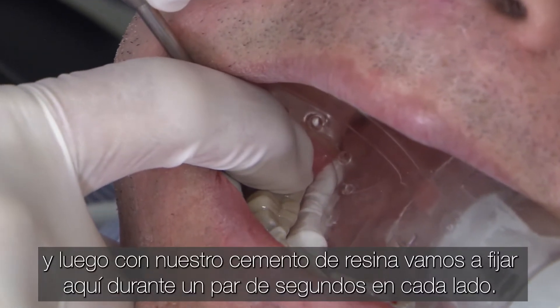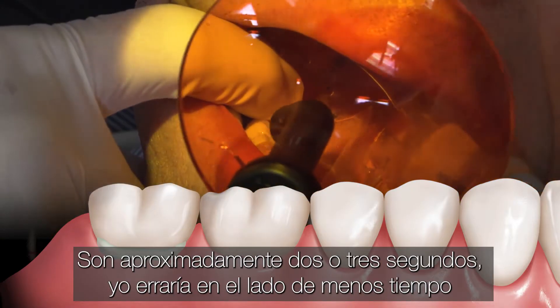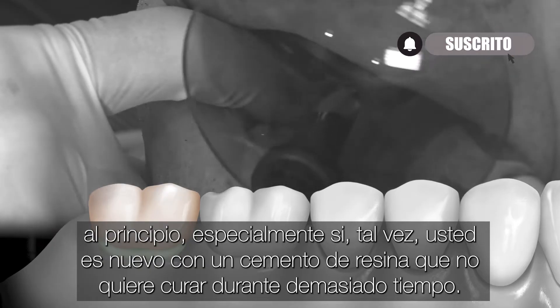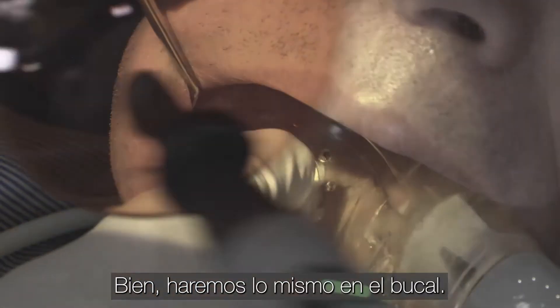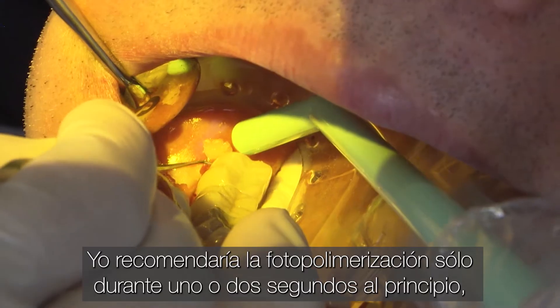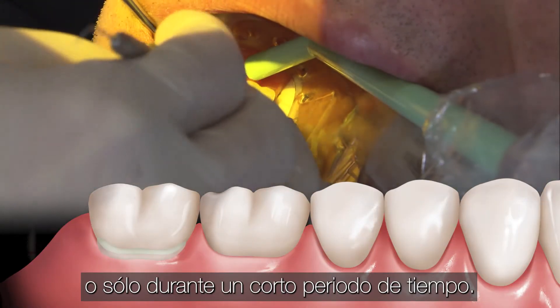With our resin cement, we will pack here for a couple of seconds on each side — about two to three seconds. I would err on the side of less time at first, especially if you're new to a resin cement. You don't want to cure for too long. We'll do the same thing on the buccal there. I would recommend light curing for just one or two seconds at first, or just for a short period of time.